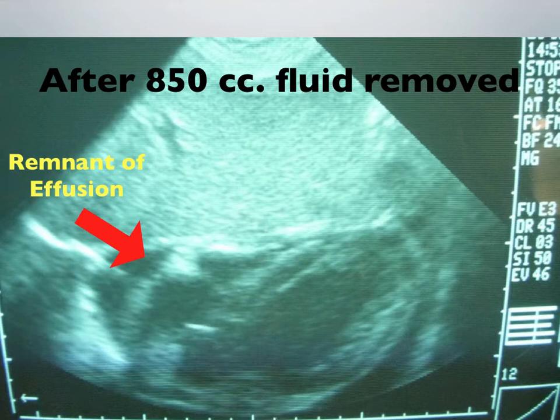Now, normally I would not recommend tapping this patient dry. This patient is relatively dry here. What you would really like to do ideally is drain the fluid enough to relieve the symptoms, enough to make the patient stable until more definitive treatment can be given. However, it was going to be a 15-hour bus ride to get her back to Accra and then be on a waiting list to have dialysis, so it was deemed important to remove as much fluid as possible.